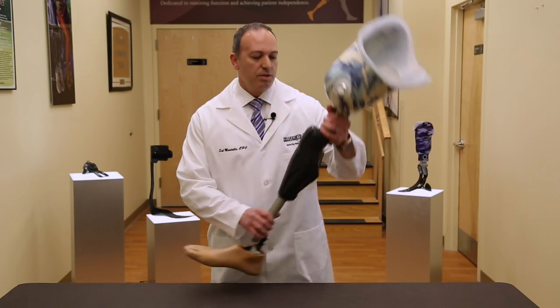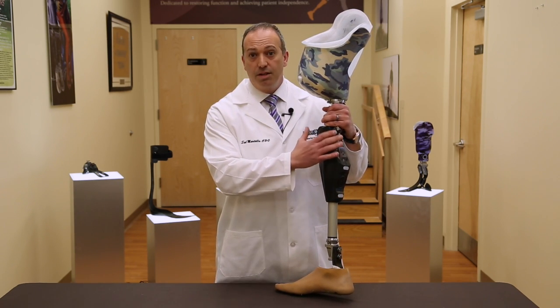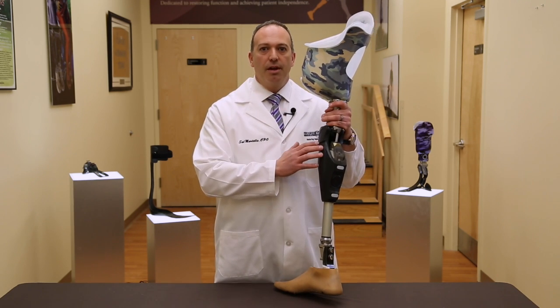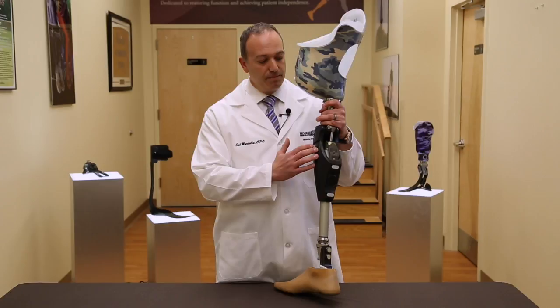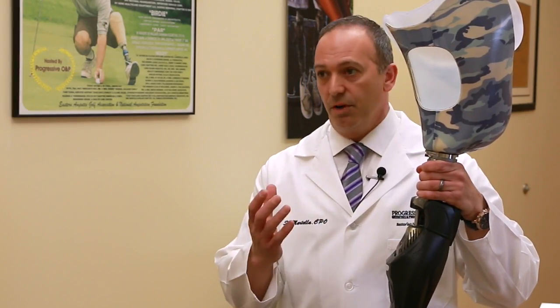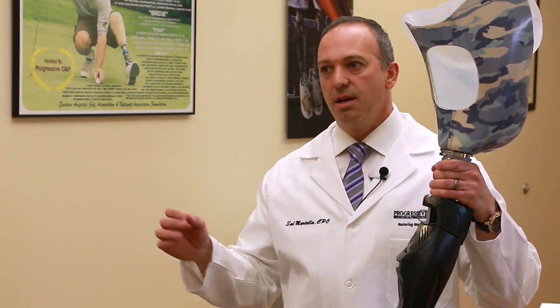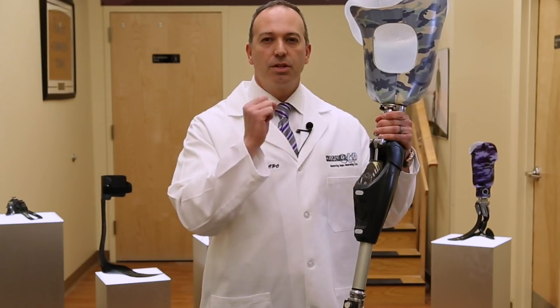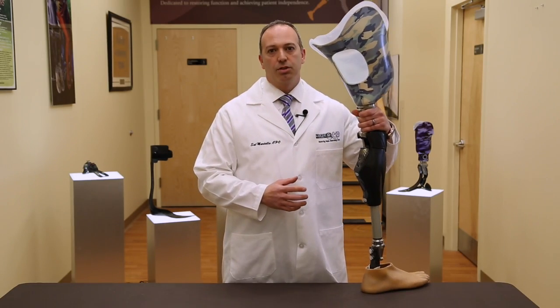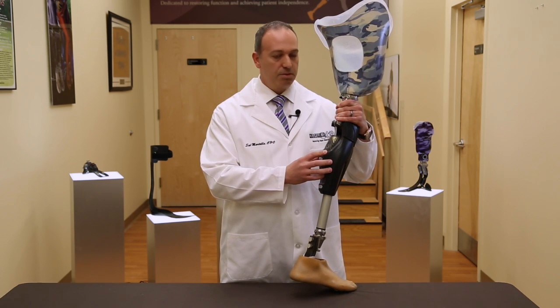The device uses a microprocessor housed inside the knee to control its hydraulic unit. This hydraulic unit has the widest range of hydraulic ability compared to other microprocessor prosthetic knees. With that high range of hydraulic function, it provides a smooth transition from both stance phase to swing phase. In the stance phase, the hydraulics are very soft and absorb a lot of shock on initial heel strike. It is one of the most comfortable prosthetic knees to actually walk on, as our patients have experienced.